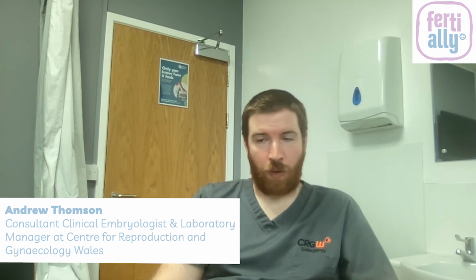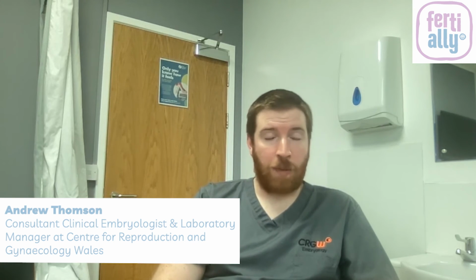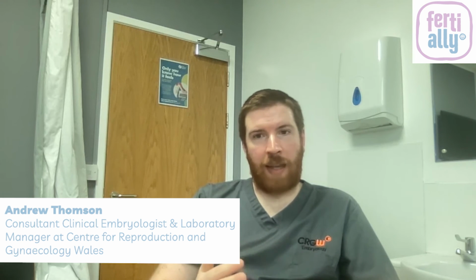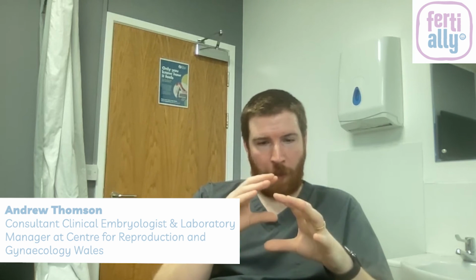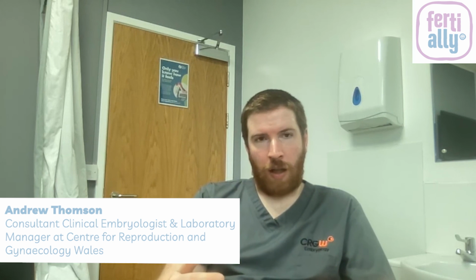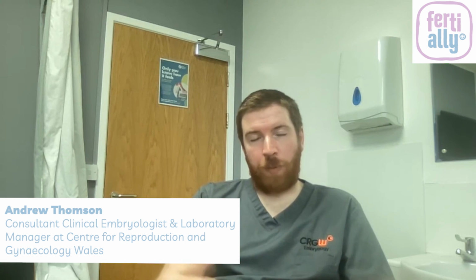And the second letter or third digit is based on the trophectoderm, which is the bit that goes on to make the placenta. And again, that's graded A to C in most clinics, but can also be graded A to D. A means that nice cobbled street effect that you might see. B means it varies between how you look at it. If you think of it again as that football, it might be good quality on one part of the football, but not so good on the other part. A grade C means those nice small cobbled effects are more like big paving slabs, and those cells get bigger and bigger and bigger. And a D would be degenerating.